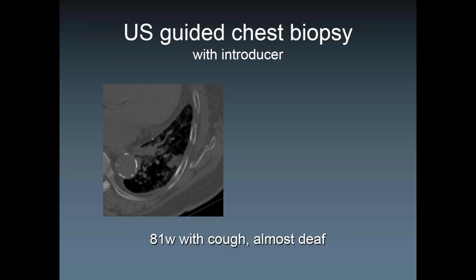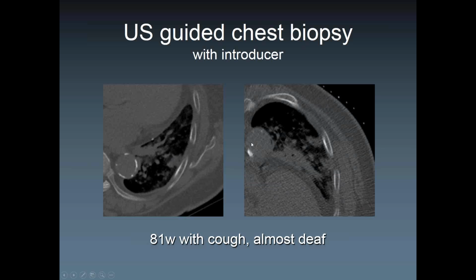the approach carefully. And then if the lesion is small, it doesn't matter, but if it's abutting the pleura, that's what matters much more, right? So if it abuts the pleura, there's always a potential to get to that with ultrasound. And this patient wasn't good in hearing either, so holding her breath in CT is basically almost impossible. So you have to do it yourself with free breathing. And this is what you do.